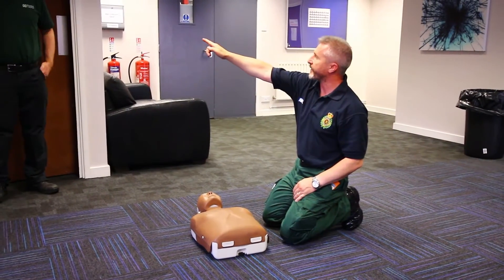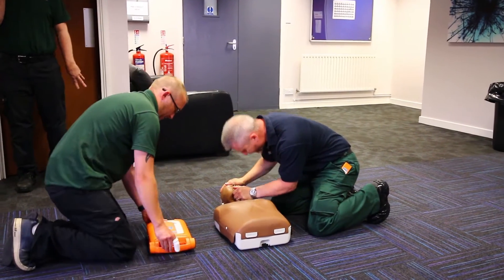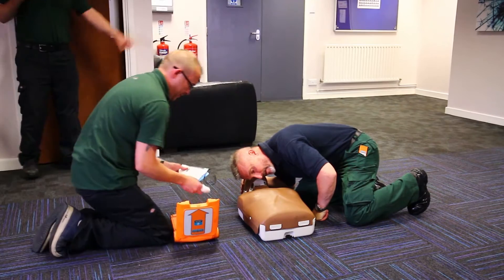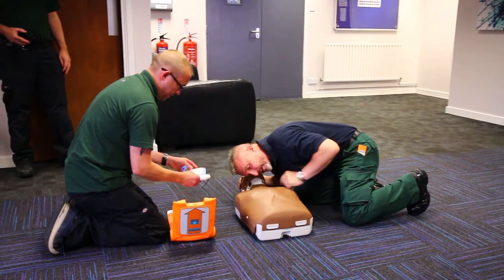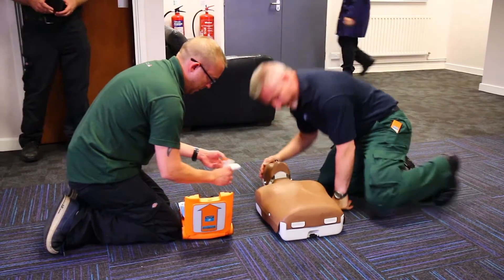Can I get ready? I need the AED down on the ASAP. Looking in the mouth — have a quick look. Airways are clear and clean. Keep breathing, 10 seconds. Looking at the chest, I can't see any kind of defib patches or medication patches. No piercings. No long earrings.